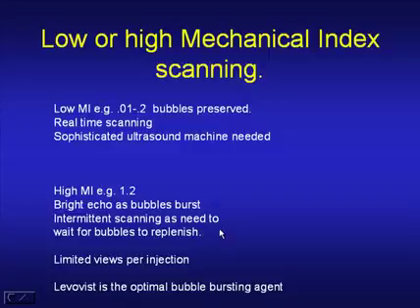If we purge the image field of bubbles, as the bubbles come back into the field from outside and replenish, we're actually visualizing perfusion at the tissue level, which is again another unique property of ultrasound contrast agents. High mechanical index gives us only limited views per injection.